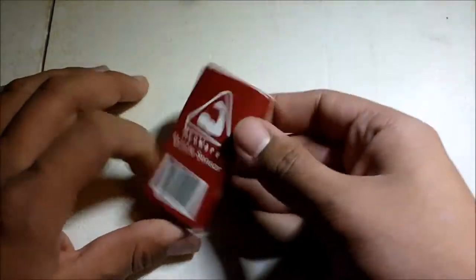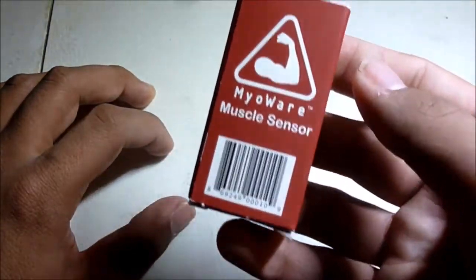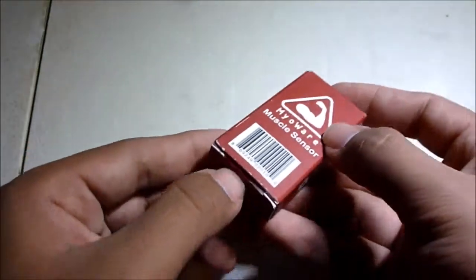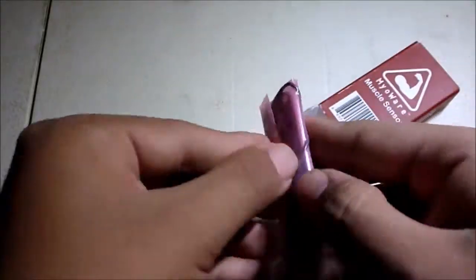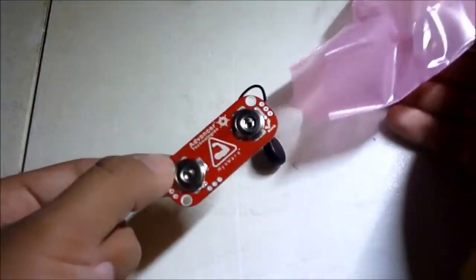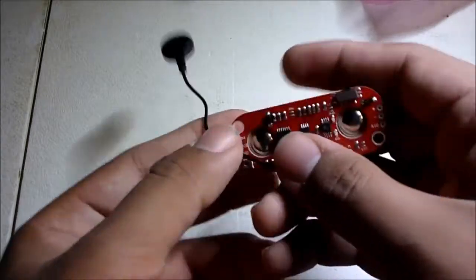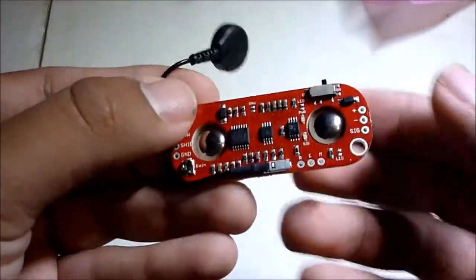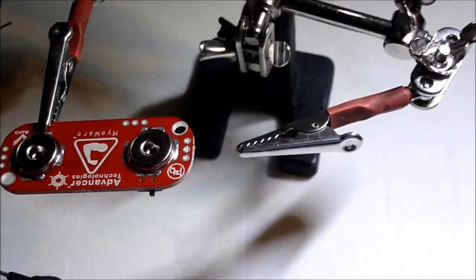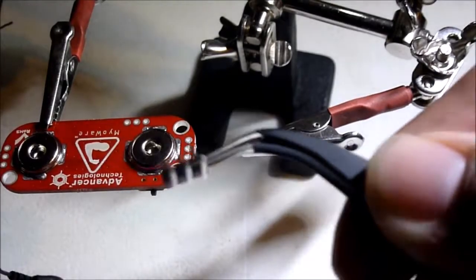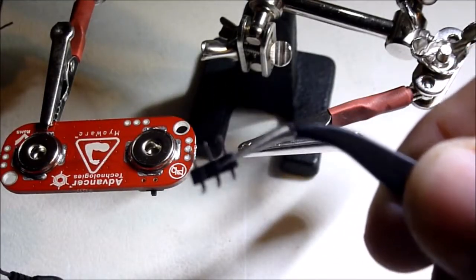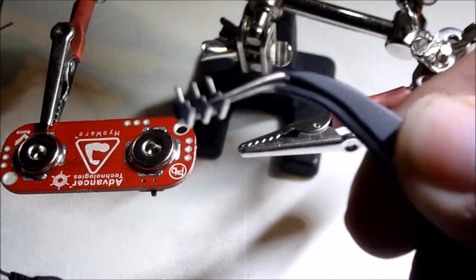So here we have the Myoware muscle sensor by Advancer Technologies. Here I have three header pins which I'm going to solder onto the Myoware.